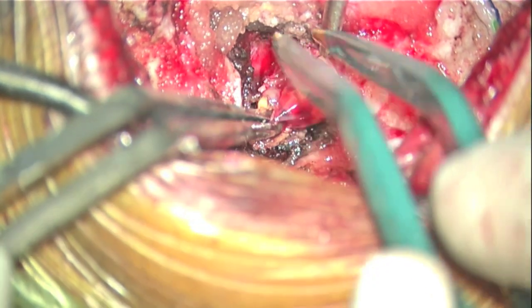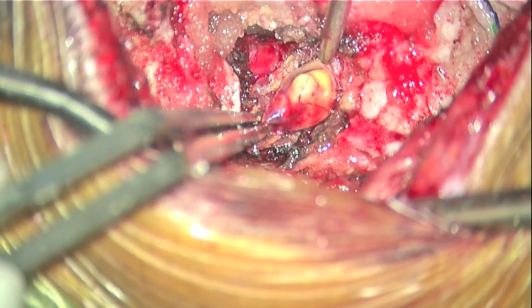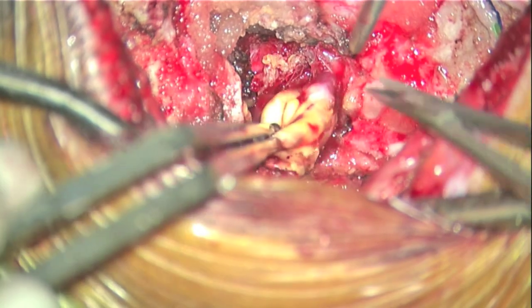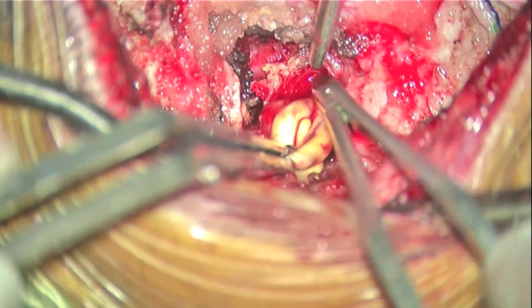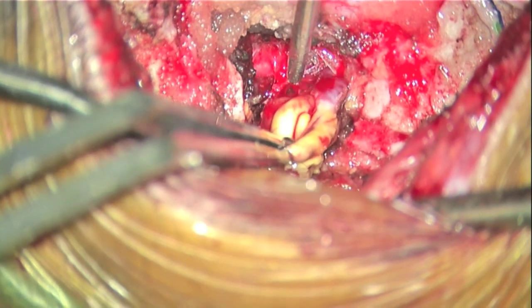If the dissection remains precisely on the tumor capsule, and you have been effective in isolating, cauterizing, and dividing fibrous attachment and feeding vessels, you can often mobilize and deliver large components of the tumor into your surgical field with a moderate amount of traction with tumor forceps.